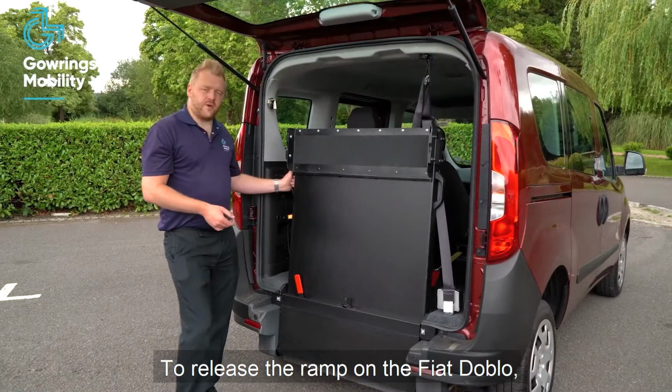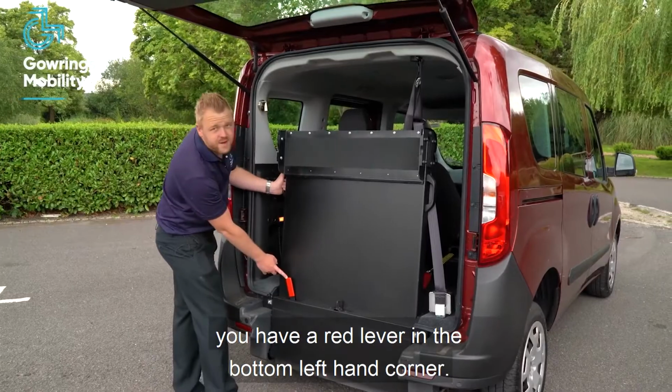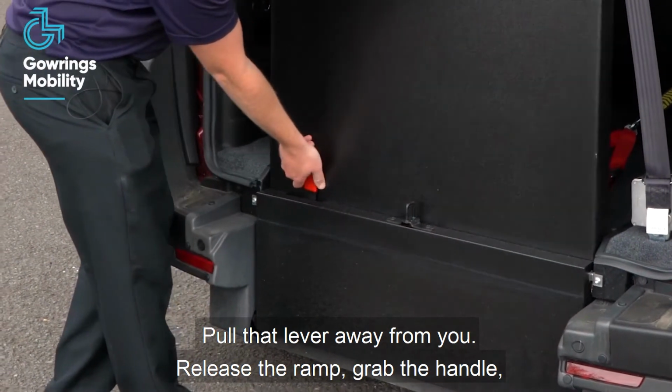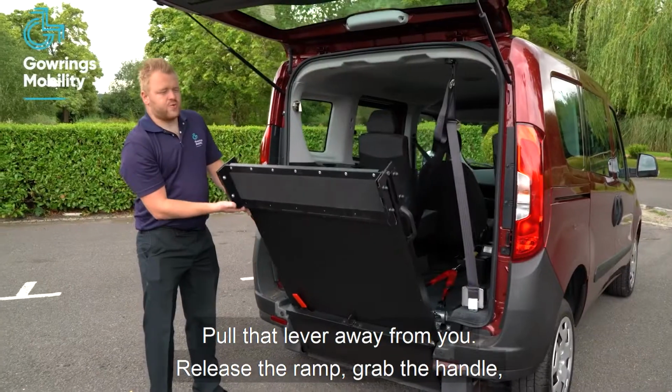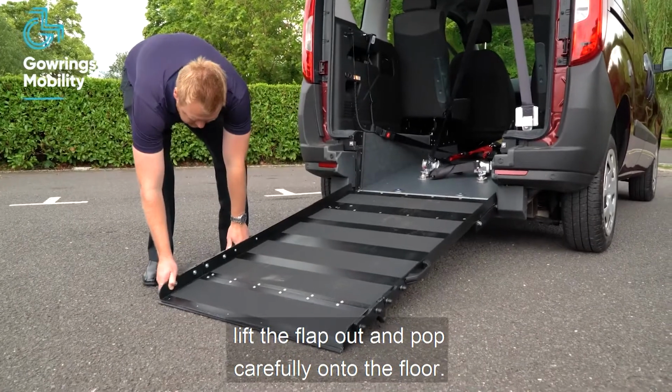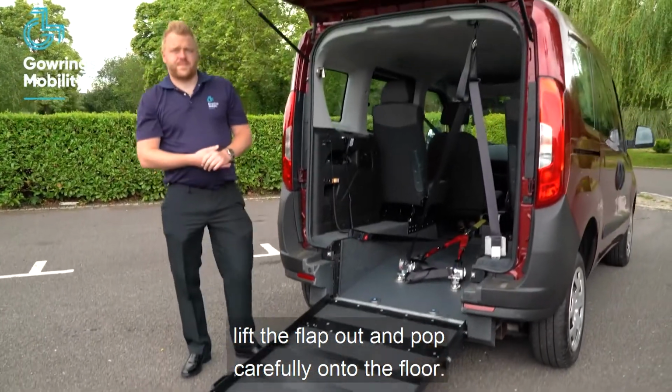So to release the ramp on the Fiat Doblo, you have a red lever in the bottom left hand corner. Pull that lever away from you, release the ramp, grab the handle, and as you're slowly coming down, lift the flap out and pop carefully onto the floor.